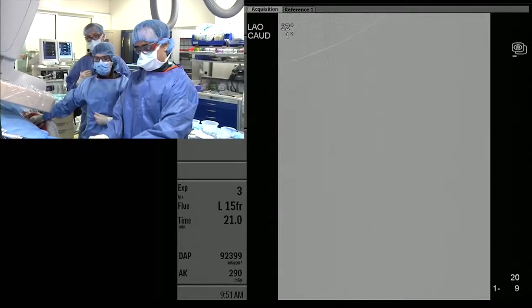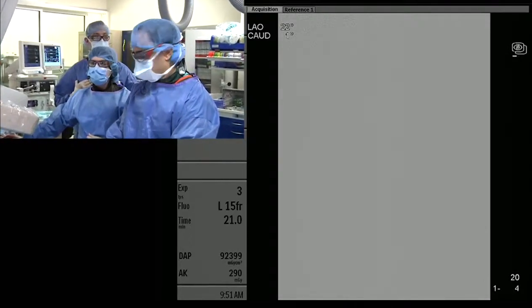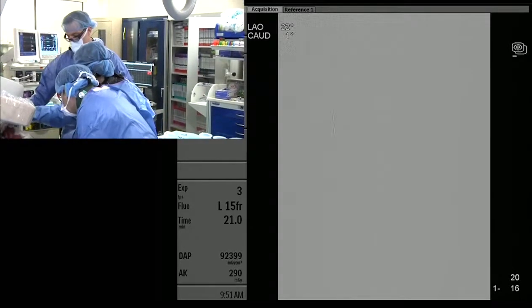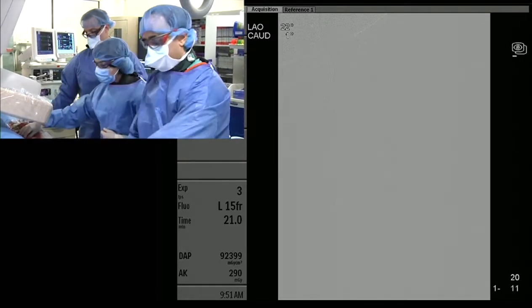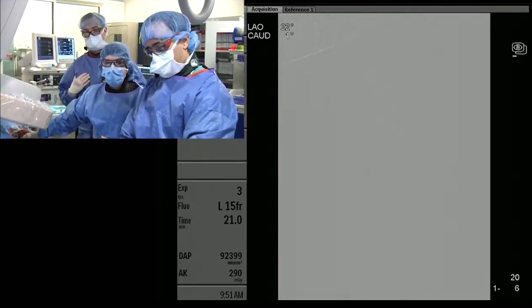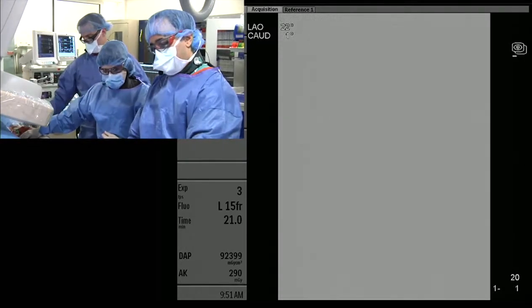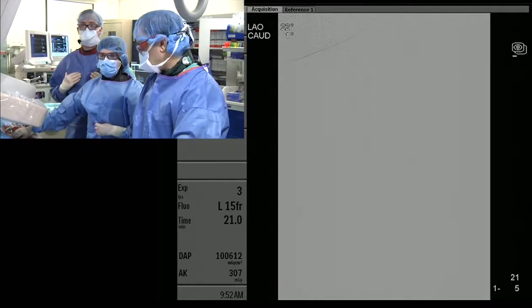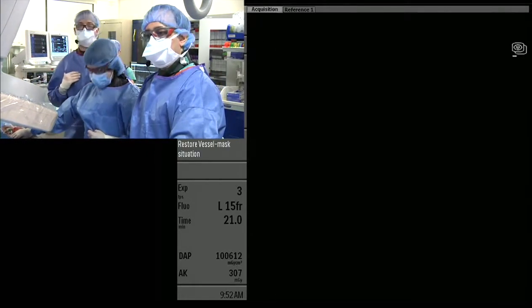The previous stent was also 6 millimeters. You can see there is still some intimal hyperplasia at the end, so it doesn't fully co-opt — it doesn't go all the way to the edges of the previous stent. We balloon dilated initially with a 5-millimeter balloon, then placed a 6-millimeter Entrust stent and balloon dilated up to 6 millimeters. The guiding catheter was 110 centimeters.